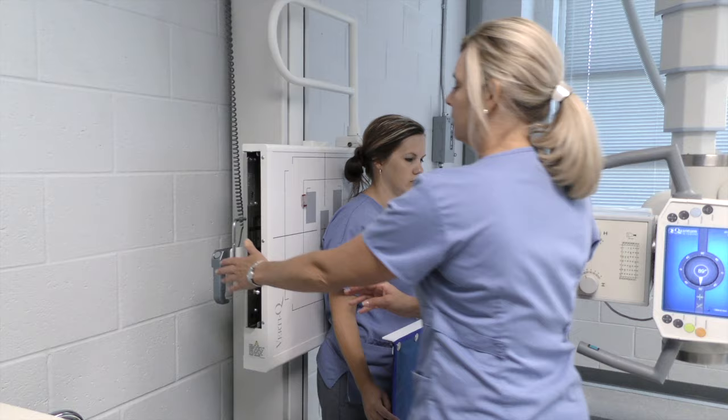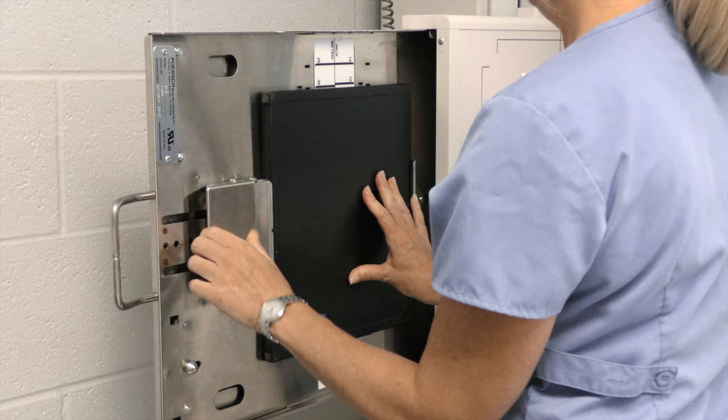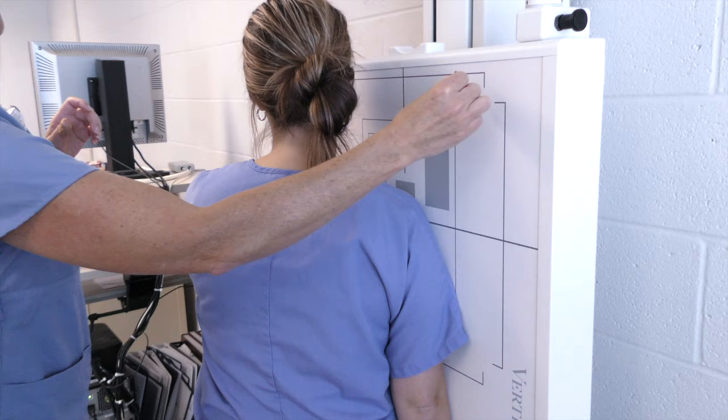The patient can relax at this point. We are going to change our cassette out for our scapula Y. We're going to do the textbook view of the scapula Y, so we're going to change it to lengthwise.